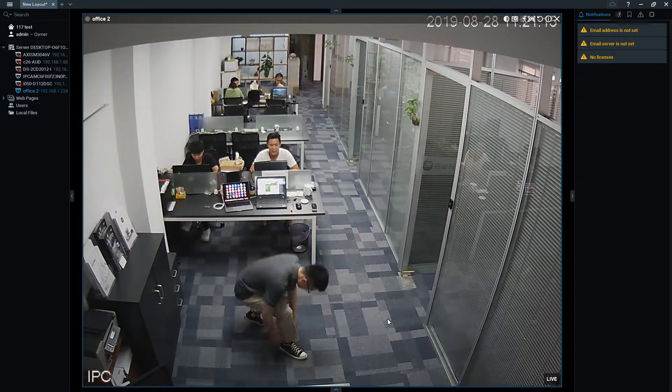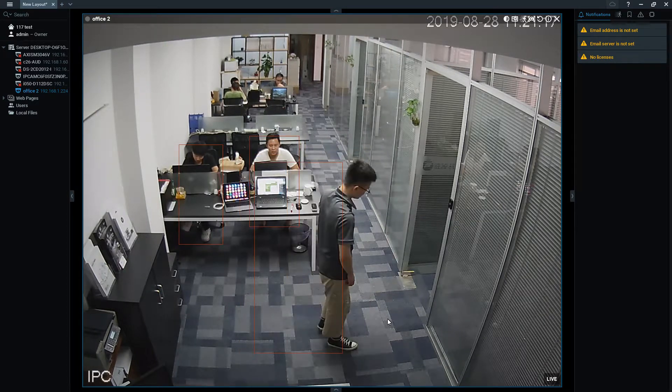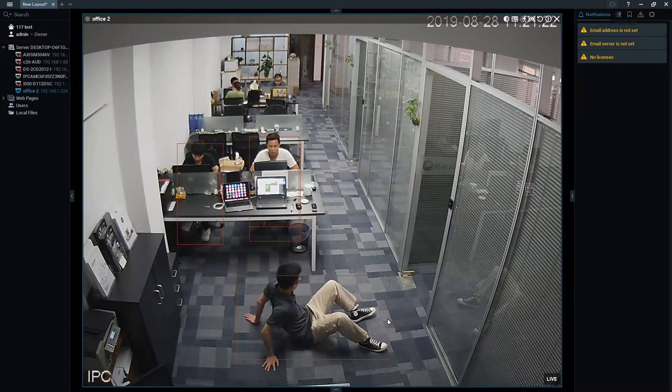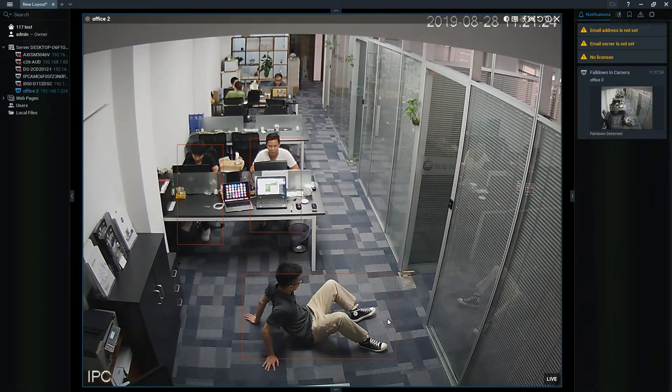The next thing we want to do is falling backwards on the floor. In hospitals, you often have patients fall on their back side. The alarm goes off on the right — very good.